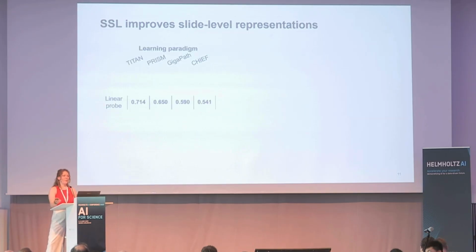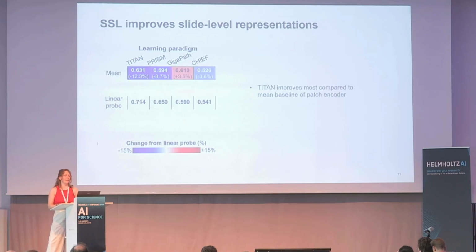but we also included more evaluations. So this is now the average on these 4 core tasks of our model on the left, TITAN, and we see that in linear probing, which is basically just fitting a logistic regression out of the slide encoding that we now get, we are outperforming the existing models. But the nice thing is now that it doesn't depend on this linear probing evaluation. We also see that we trained a good slide encoder by comparing it to other evaluation schemes.